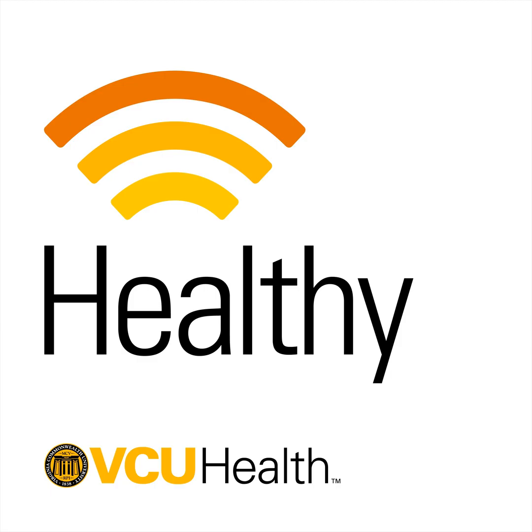So this is a critical step because the way the technology works is it transmits ultrasonic energy from multiple sources that travel through your skin and through your skull down to the target where we're creating a lesion. And if you have hair, that disrupts the smooth transition of that energy and makes it unpredictable enough so that we can't control where it goes.